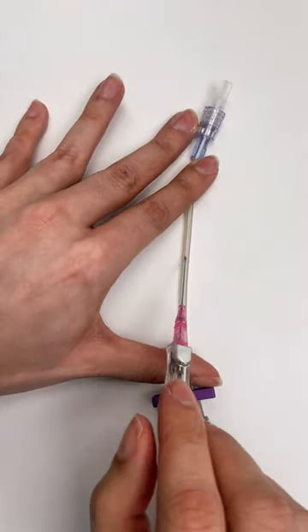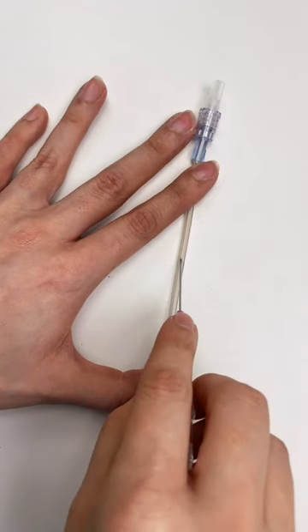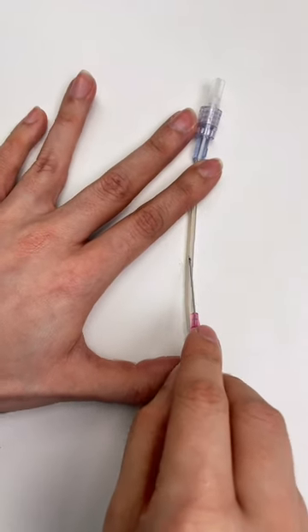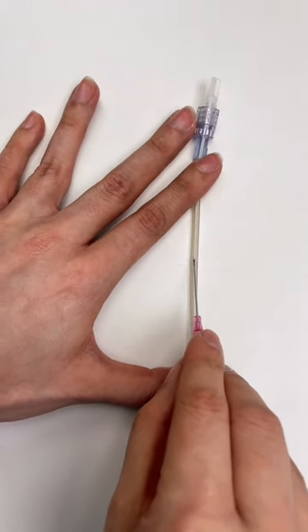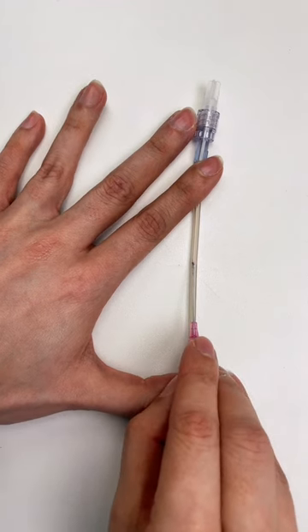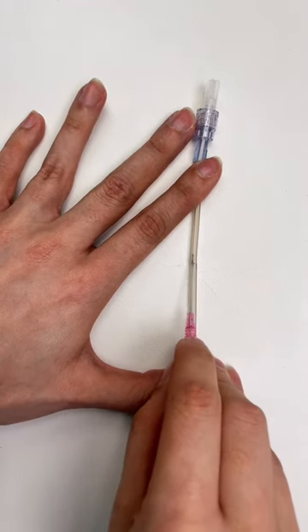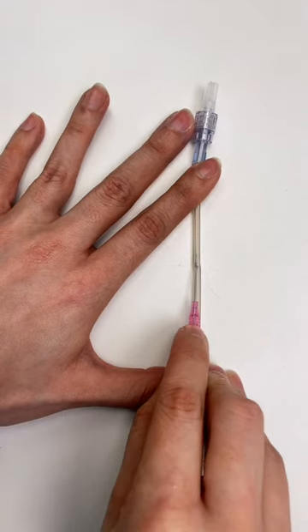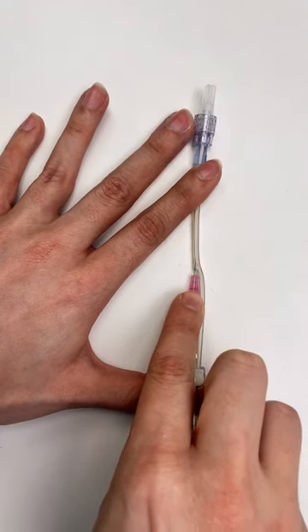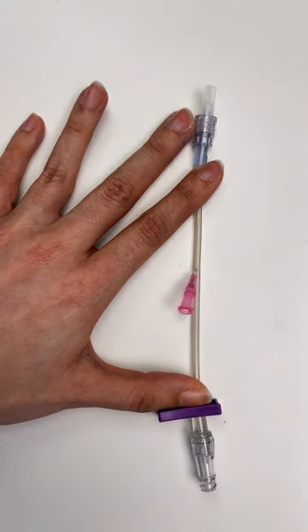So when you get flash, that's awesome. It means that you have actually pierced the vein. Now though, is the time for you to situate that catheter by dropping your angle, advancing the IV catheter a little bit farther, and then you're going to be able to actually slide the catheter off, leaving it in your patient's vein.